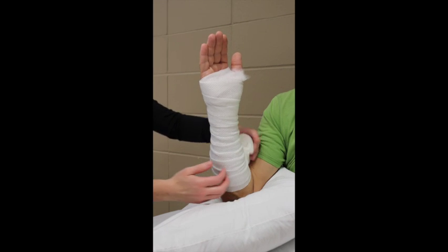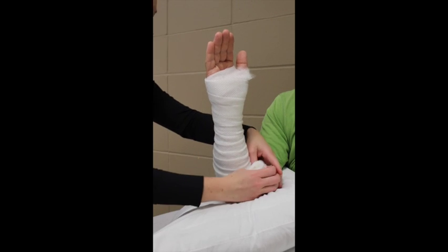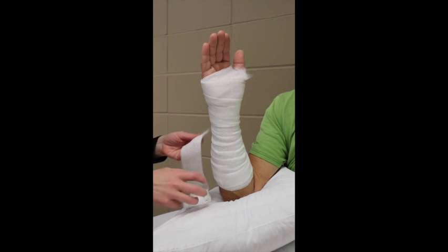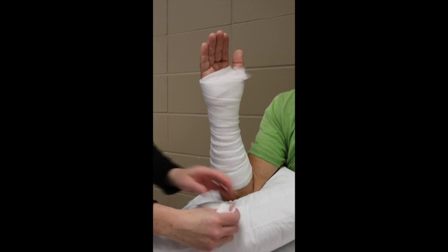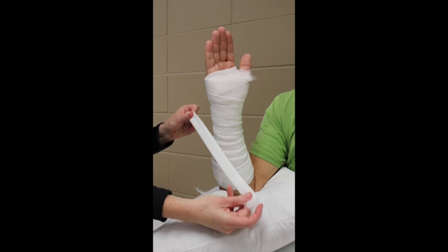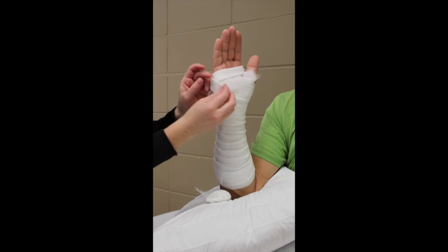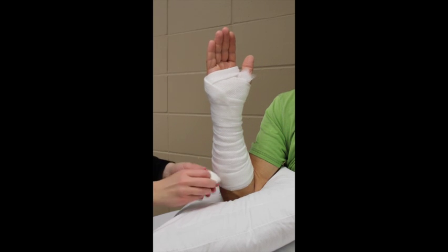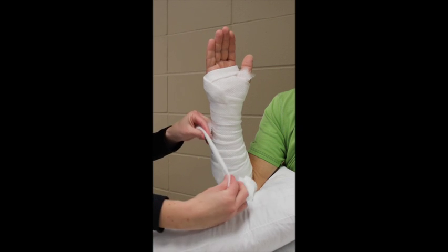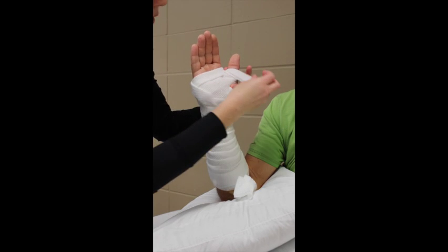We want two layers of padding in the hand and forearm, and about three to four layers of padding at the ends to avoid the splint rubbing on the skin — about one to two inches from the antecubital fossa. Go around until you have about three or four layers of padding. Next, create a cuff to add layers in the palm: take a piece, fold it lengthwise, and wrap it around the distal end of the padding so we now have four layers. Take another small piece to create a cuff about the thumb — fold it lengthwise and wrap it around the thumb, much like a breast cancer ribbon.